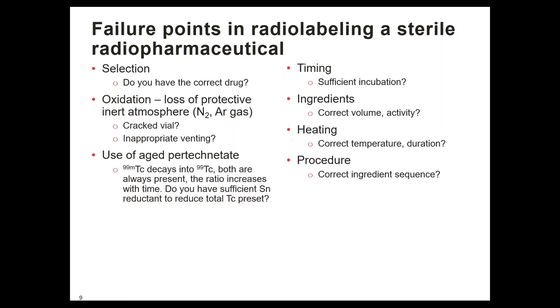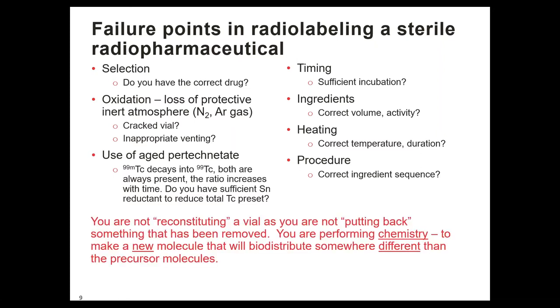Many of the drugs require that ingredients are added in the correct order. Sulfur colloid requires acid before base. If it's in the wrong order, it will not work. Zevalin and Octreoscan, I believe, have an acetate buffer solution that's got to be added to the indium chloride or yttrium chloride to adjust the pH, otherwise you're going to denature that poor antibody protein. So it's important that things happen in the right order.